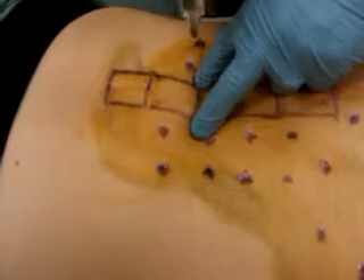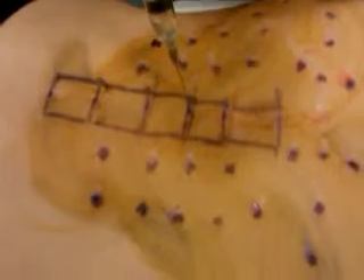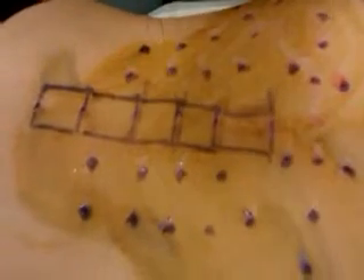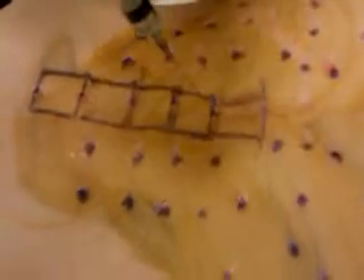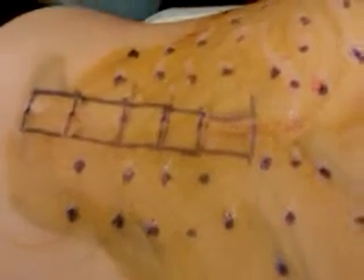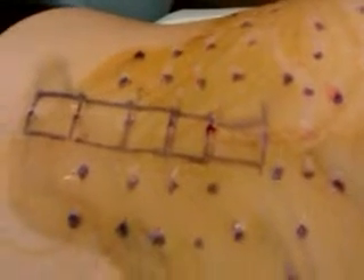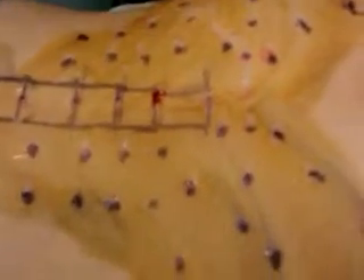Right now it's not hard, but once I go to the scar it might be a little more problematic because it's not going to be very easy to cut. But closer we're coming to the scar — now it's become very difficult to inject. I feel the scar. I have to put a lot of pressure — I'm getting immediate results and a lot of resistance from the scar.